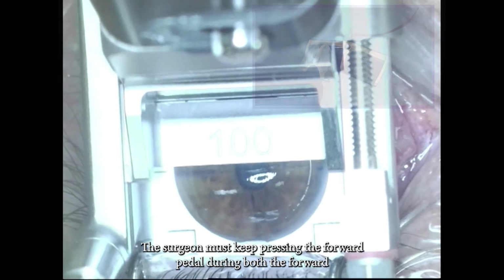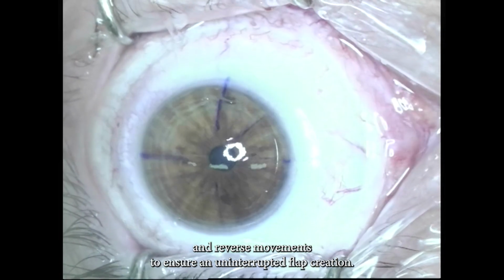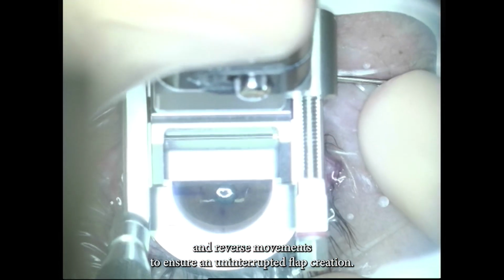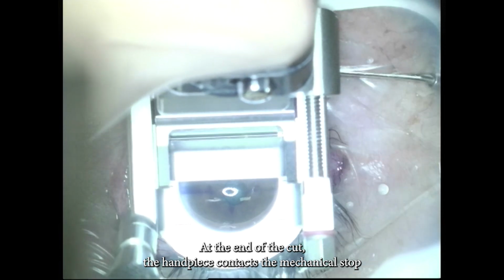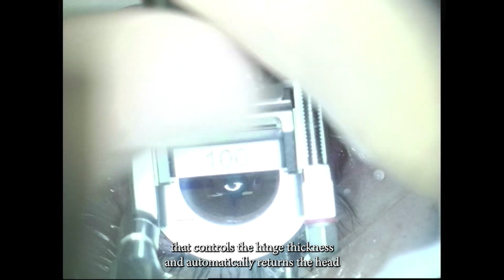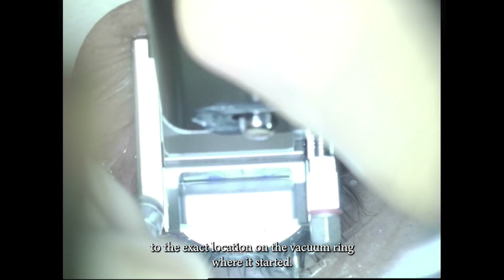The surgeon must keep pressing the forward pedal during both the forward and reverse movements to ensure an uninterrupted flap creation. At the end of the cut, the handpiece contacts the mechanical stop that controls the hinge thickness and automatically returns the head to the exact location on the vacuum ring where it started.